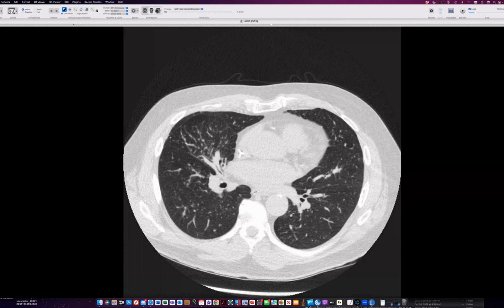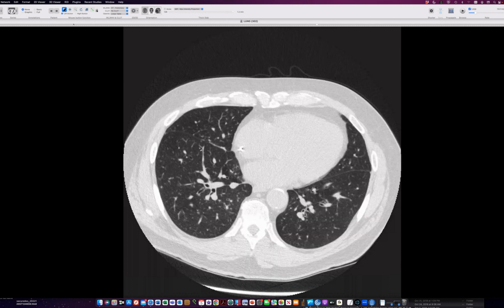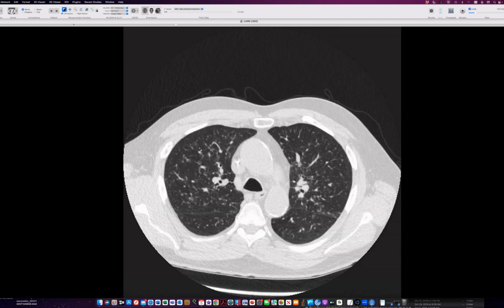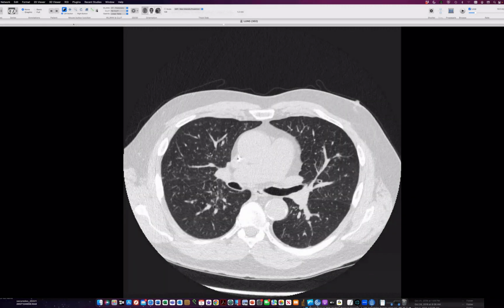He had a previous CT a couple of years before and there was nothing like this in there. So this was attributed to a sarcoid-like reaction to his chemotherapy agents for his colon cancer. I was going to look up those agents and see which one. It was one of these cocktails he was getting as adjuvant therapy to assist resection of a sigmoid lesion. So this is a sarcoid-like reaction here, with lots of tiny little lung nodules. Okay. Interesting. Very good.